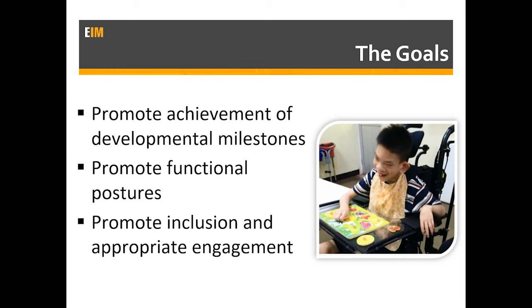So it's always just a little bit trickier when we consider how to provide a functional, usable, user-friendly wheelchair for pediatrics. But remember what we're trying to achieve here. What are our underlying goals? It's really to get these kids active, participating in their environment, learning and developing as close to their able-bodied counterparts as they can. We can objectify that if we look at developmental milestones. We can look at them compared to what an able-bodied counterpart might be and where those milestones are.